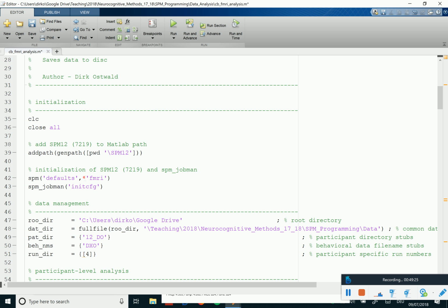And for EEG, which we will not cover this term anymore, it works exactly the same way. So you have to specify data, you have to specify some default parameters, you have the problem that you don't quite know what SPM is doing, but you can use a toolbox, and everybody thinks this toolbox is great. 70% of people in the brain imaging field use SPM.